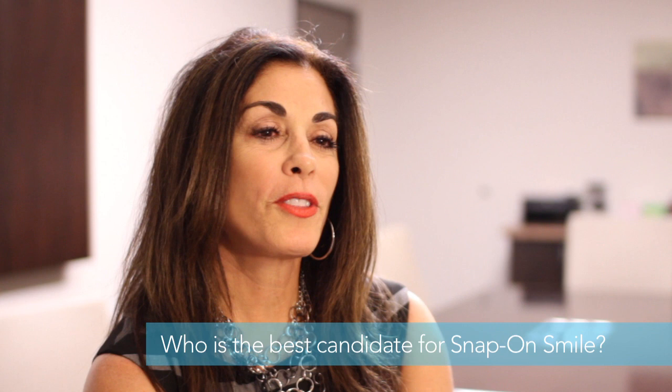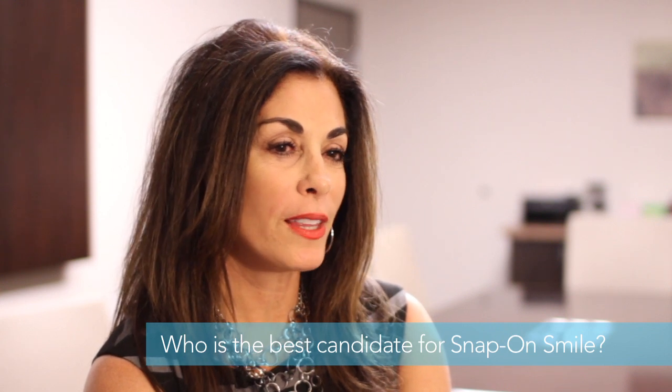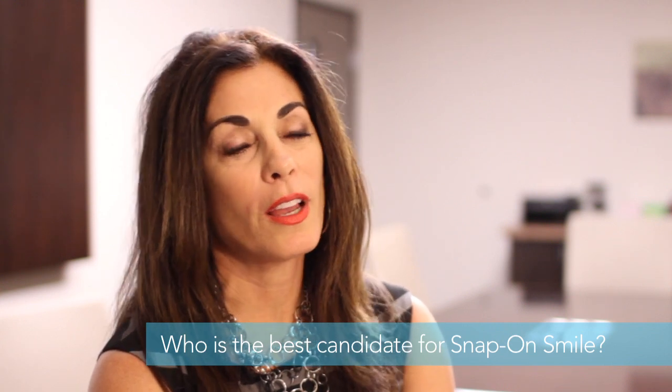The best candidates are those that have smaller teeth, and of course in a more ideal occlusion and alignment. Those patients that have teeth that are protruded or flared are not going to be your best candidates because the appliance adds thickness and then it becomes a little bit too bulky. So you have to be really, really careful in your case selection. That's really important. Of course, if they have active decay or periodontal disease, they won't be a good candidate.